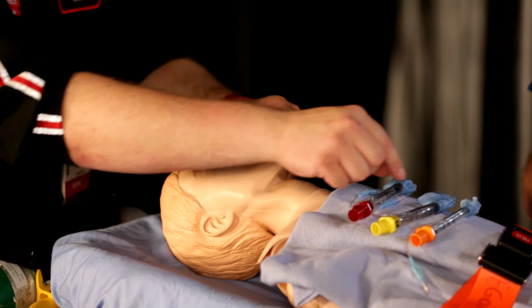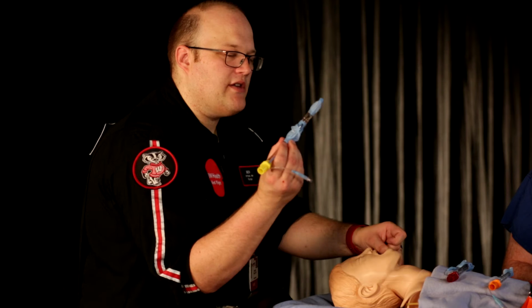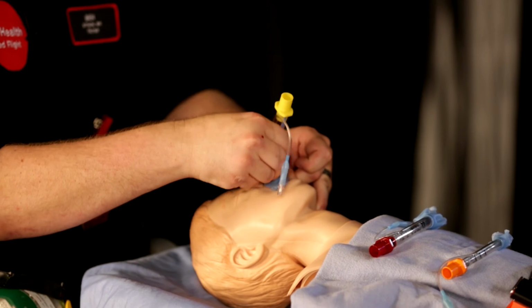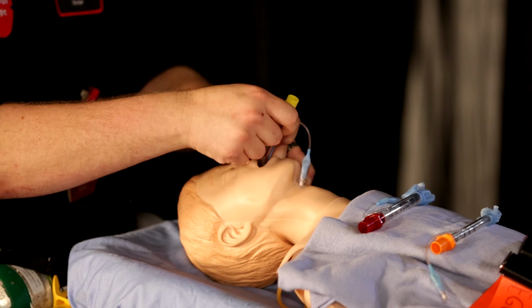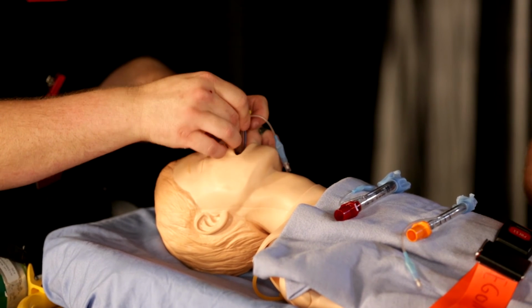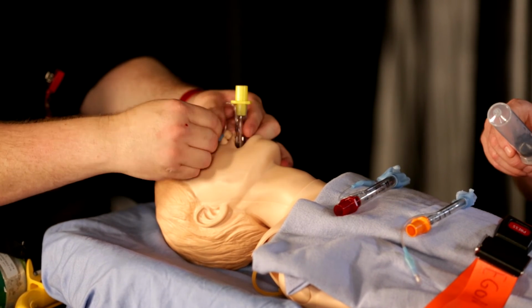So I want to make sure the child is good and asleep. I'm going to open the airway wide. I'm going to take my tube. I choke up usually, so I'm holding it just about at the balloon. I'm going to direct it down, feel it make some passing movements. There might be a little bit of resistance. I feel it seat, and then I'm going to push and feel a good seating. It's not too much pressure, but it's not going to move if I wiggle it just a little bit.